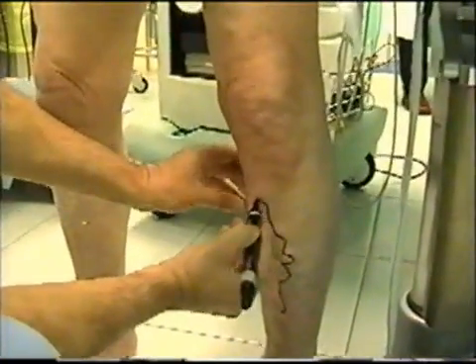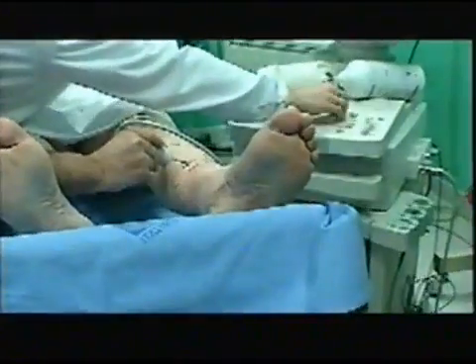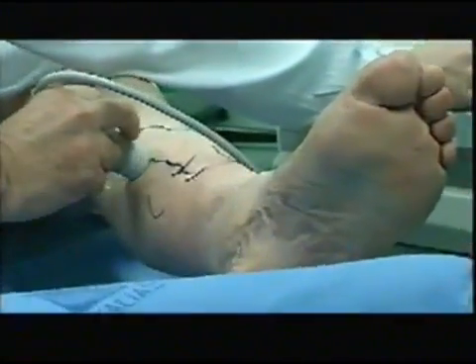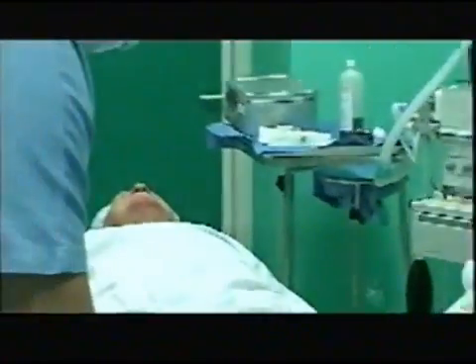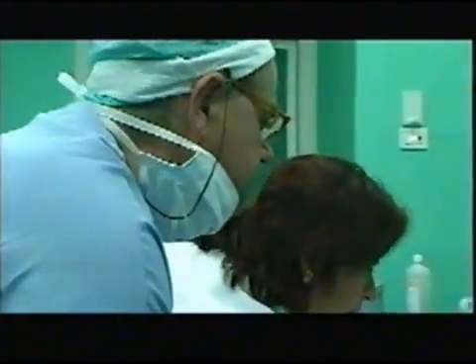Lower leg vein insufficiency with varices is a very common disease in middle-aged and elderly people. Echodoppler exam is the gold standard to define in a very accurate way the details of functional and morphological defects.